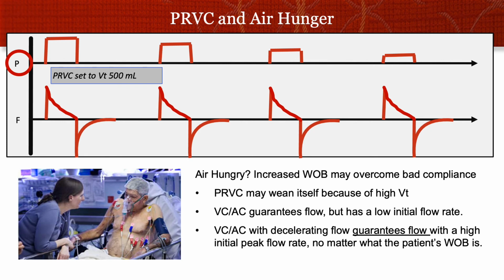Wonderful thing, except now he had pulmonary edema, a little contusion from compressions, and his SAT was 90, 92, he's holding on, but he was working very hard to breathe from the irritation to the lung and the pulmonary edema. And he was a strong guy. And they said his troponin was rising, and if it rises again, they're going to bring him back to the cath lab. But he looked so uncomfortable that they hoped I could look at the vent in the meantime to see if I could get him comfortable.